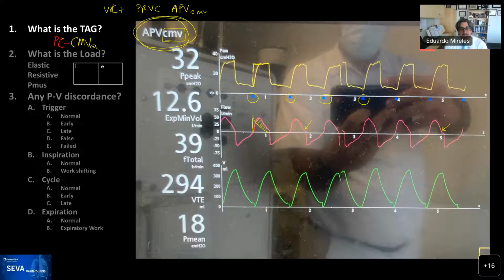of knowing that this is adaptive, meaning if the patient starts doing more effort, and just remember the graph that we have reviewed many times, where you have the work of breathing or the pressure that the ventilator delivers, and here you have the pressure from the patient.